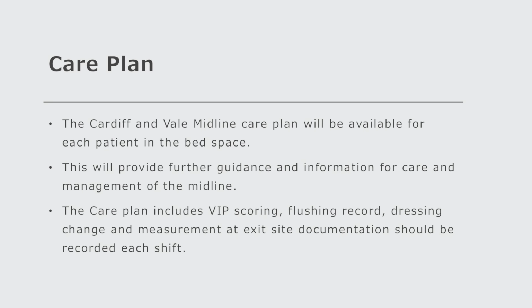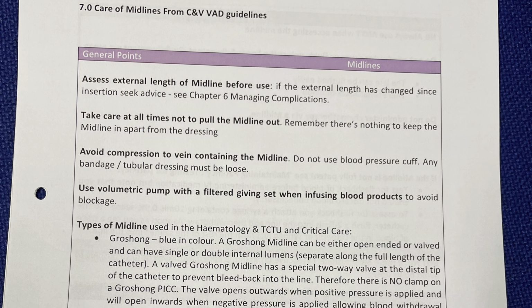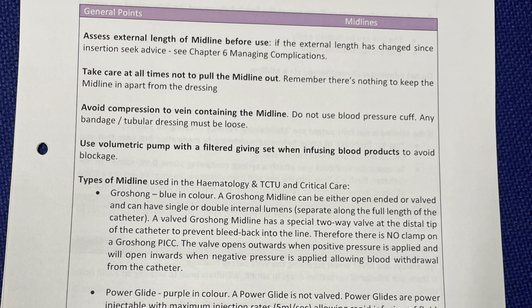The Cardiff and Vale midline care plan will be available for each patient in the bed space. This will provide further guidance and information for care and management of the midline. The care plan includes VIP scoring, flushing record, dressing change and measurement at exit site documentation, and should be recorded each shift.